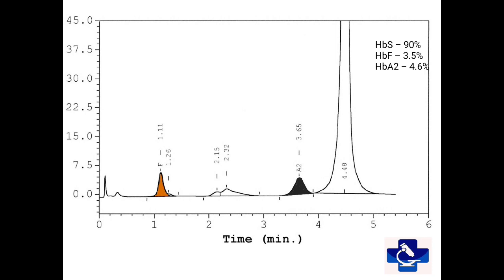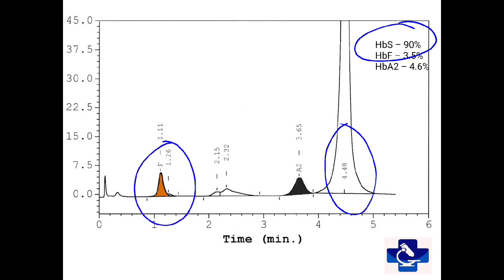In this graph, we have the sickle window of around 90% with a retention time of 4.48. Hemoglobin F is slightly raised. A2 is slightly raised at around 4.6% and HbA0 is near about 2.5%. A0 is actually absent — it is glycated hemoglobin S that falls in this region. This is the case of sickle homozygous or sickle cell anemia.